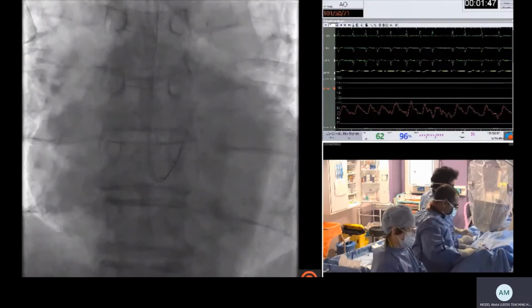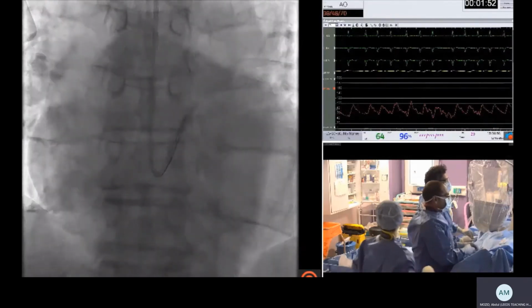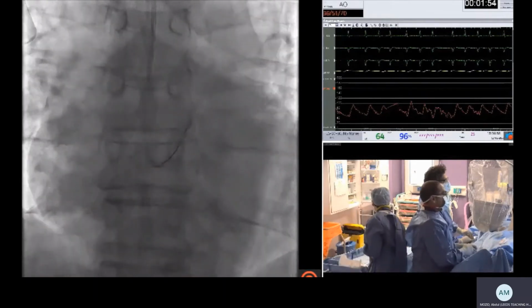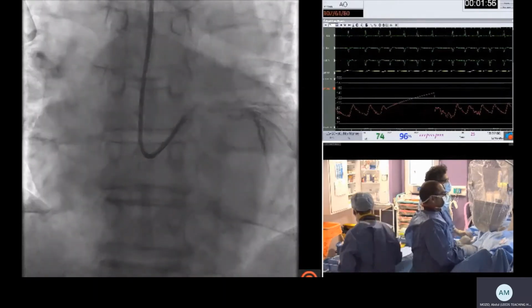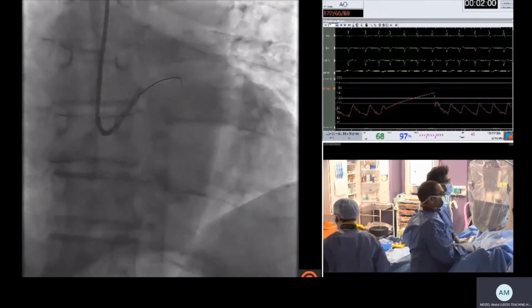So we discussed urgently with the surgeons, and due to the acuity of the presentation, it was decided to proceed urgently to PCI. The plan was to perform this using 7 French radial access with a strategy of minicrush bifurcation stenting. So this is a 7 French Voda left 3.5 guide catheter delivered from the right radial.